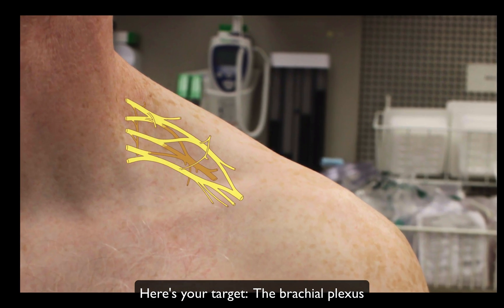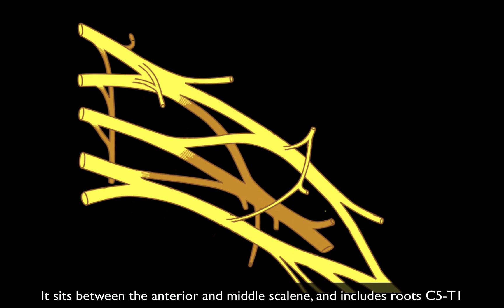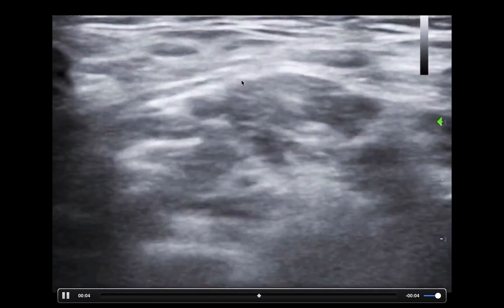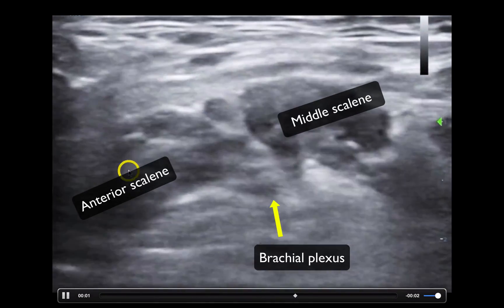Your target is going to be the brachial plexus as it lies between the anterior and middle scalene muscles. What we're aiming for is the brachial plexus trunks, just past the roots — T1, C8, C7, C6, C5 are the roots, and over here are the trunks. This is usually what you're targeting, at about the level of the C6 vertebral body. Over here we have the carotid artery and the sternocleidomastoid muscle. Move a little more laterally in the neck until you find the anterior and middle scalene.